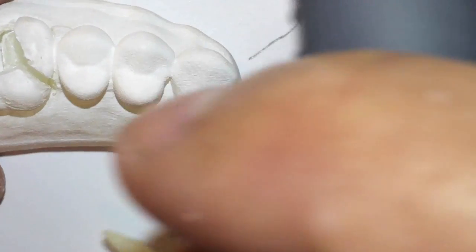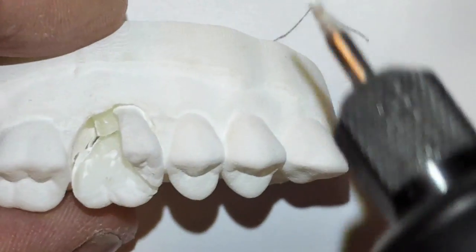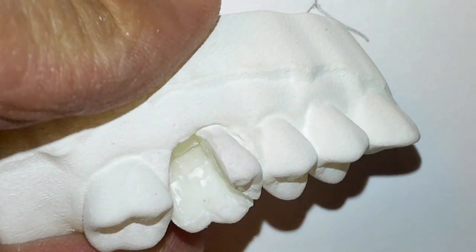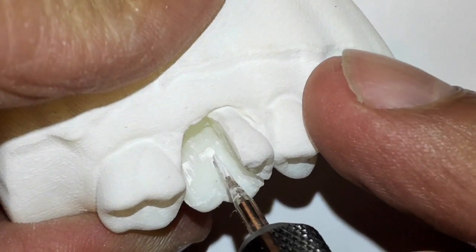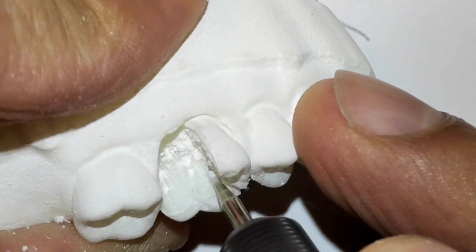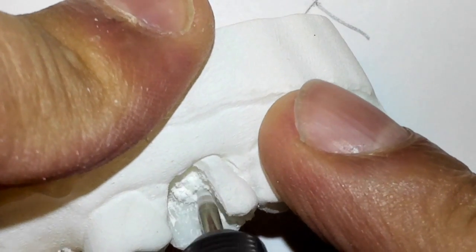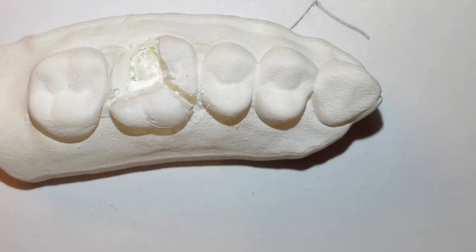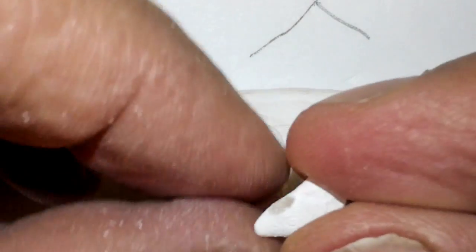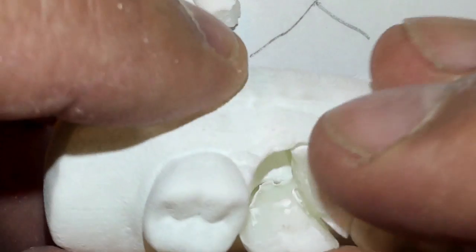I'll just go in. If your oral surgery is your game, this is a really good lesson in sectioning a tooth. So I'm just following the mesial lingual groove now of the cut, cutting through. I got more access — I can actually cut through better now. Look at that — I blew air and the root tip came plopping right out. So this is the distal buccal root tip; it's now out. And now you can see the other two are in there.